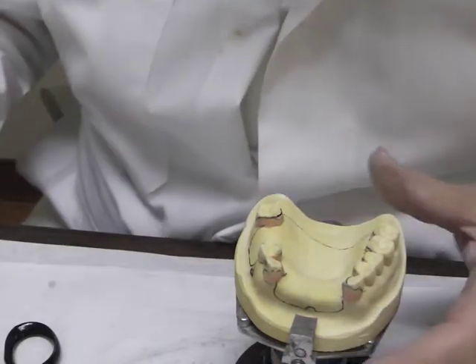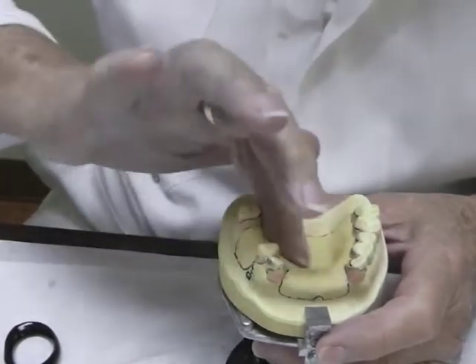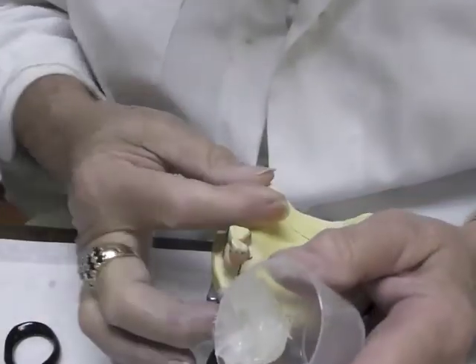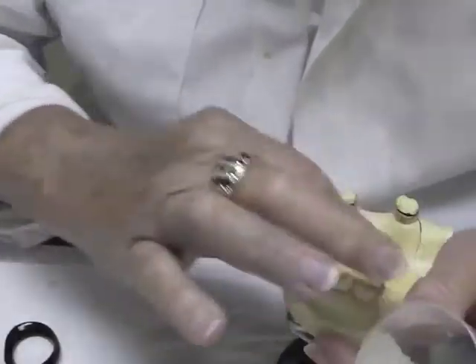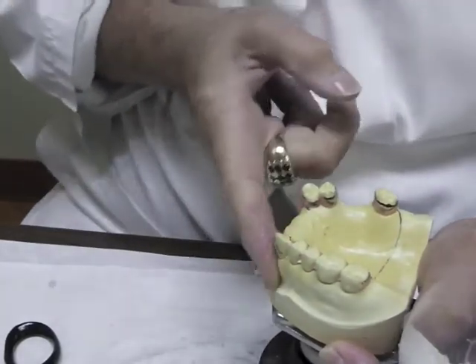I'm now going to add triad to my maxillary. First I want to place a thin layer of Vaseline under where my triad material will be. There's a little bristle brush that's good for this. You don't want it really thick — just under the areas where you're going to have base plate. That brush is good to get into those areas.